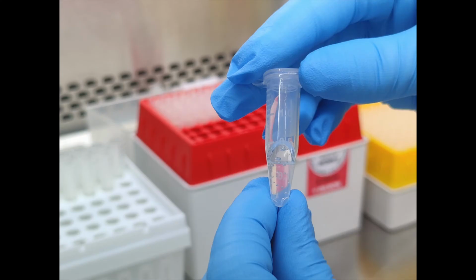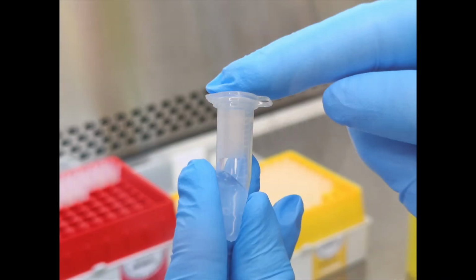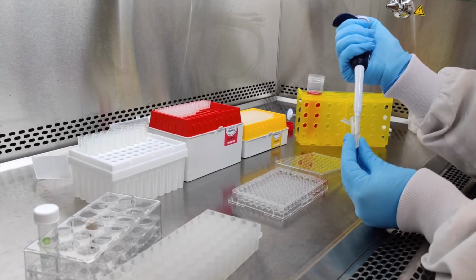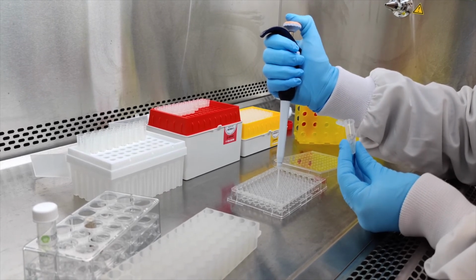To remove bubbles after mixing, centrifuge at 2500 G for 1 minute. Dispense PeptiGel and cell mixture into wells of a multi-well plate. Ensure the entire surface of the well is covered.